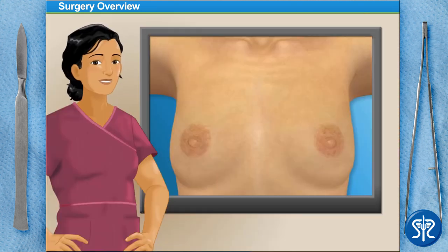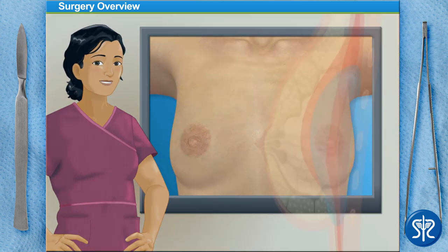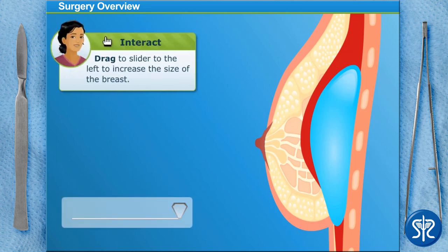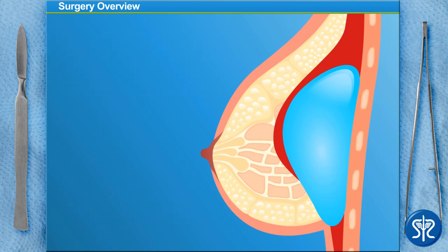Our patient feels that her breasts are too small and wants to augment them through surgery. She has spent time with her doctors to understand what is involved in the surgery, as well as the benefits and risks. Her surgeon offered a computer program that simulates what the patient would look like with different breast sizes. Use the slider to demonstrate to our patient what she would look like with different sized breasts. It looks like our patient has chosen a size she likes. Let's scrub in and get to work.